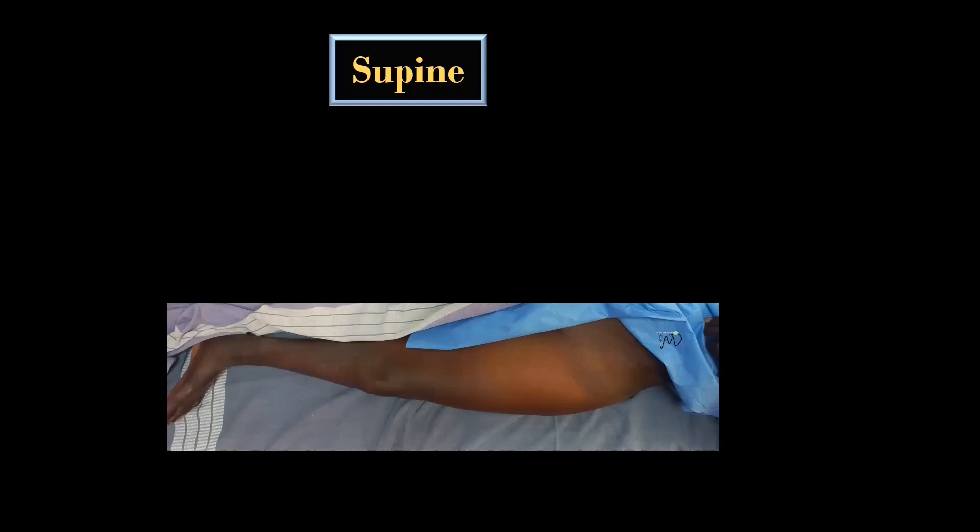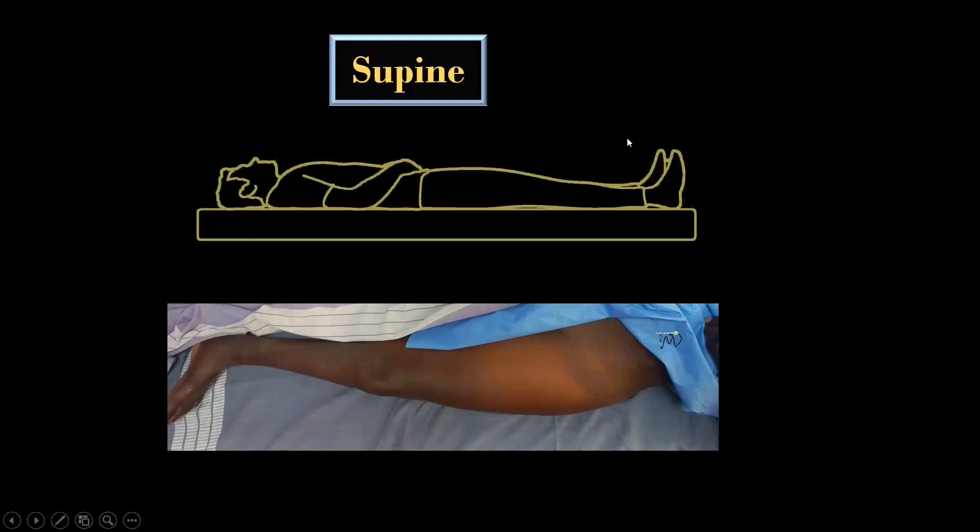For this block, the patient lies supine and the ipsilateral leg is kept extended at hip and knee joints. The inguinal crease, anterior superior iliac spine, pubic tubercle, and the inguinal ligament serve as important landmarks here.